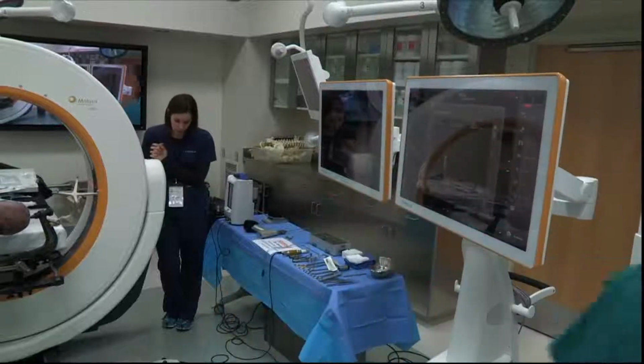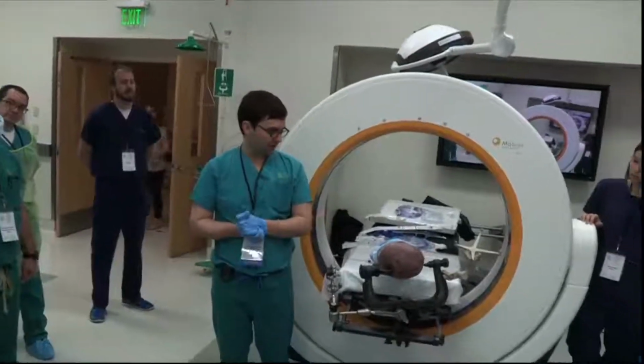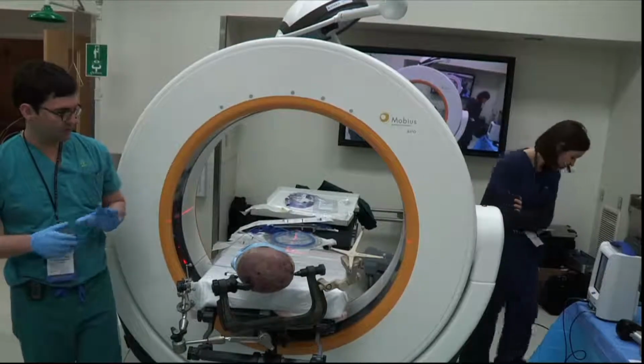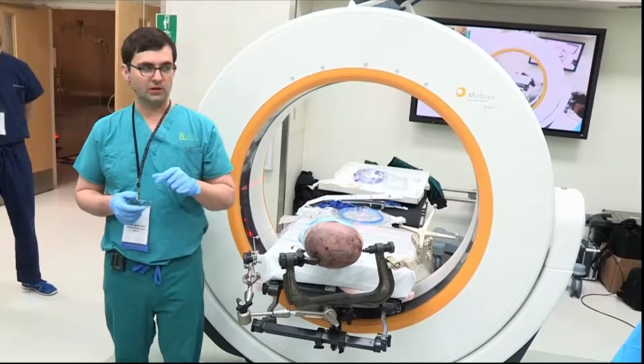So I'm going to be demonstrating the placement of a Visualase catheter for ablation of the amygdalohippocampal area for temporal lobe epilepsy. So basically, this is our setup that we use. We use the intraoperative CT scan, bring the patient in. We already have our MRI. We've already planned our trajectory.